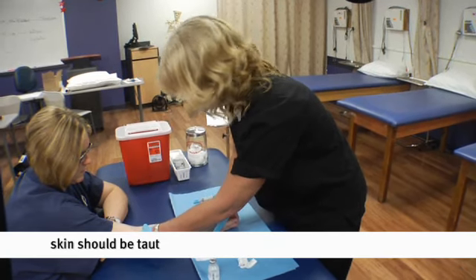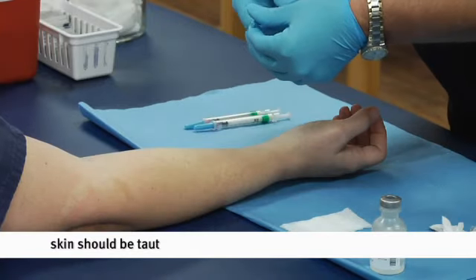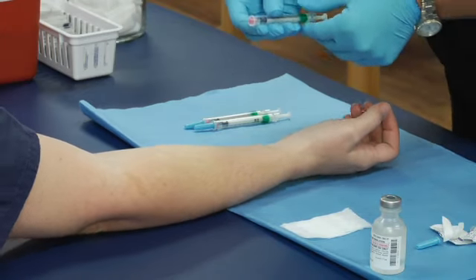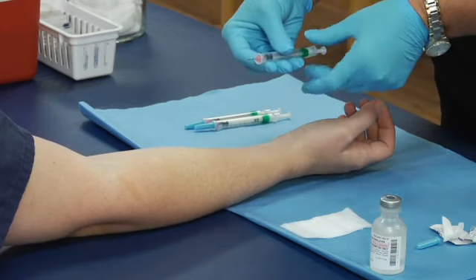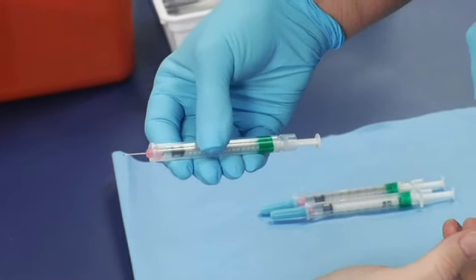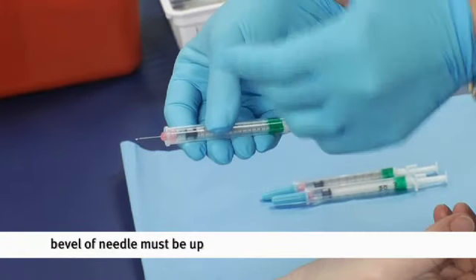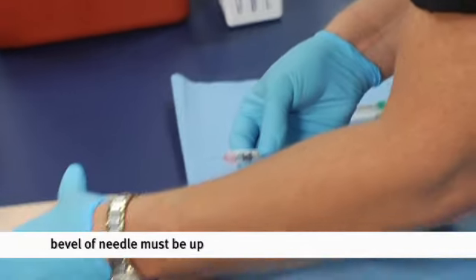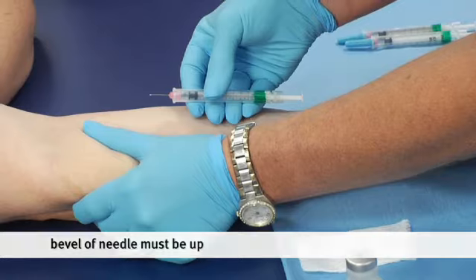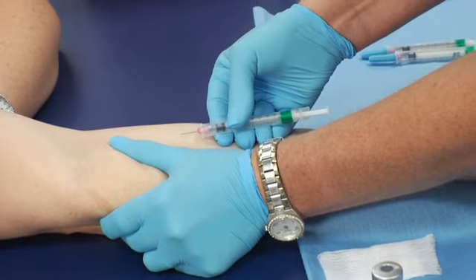This is for tuberculosis — we're going to do the TB test. I take the syringe with four fingers on the bottom and my thumb on top. I take note that I can see my medication — you always want to be able to see your medication — and it's still at the correct dosage. I have my bevel up; bevel must be facing up. I grab the skin from the top and pull, and my fingers pull from the bottom, giving us a nice tight skin.